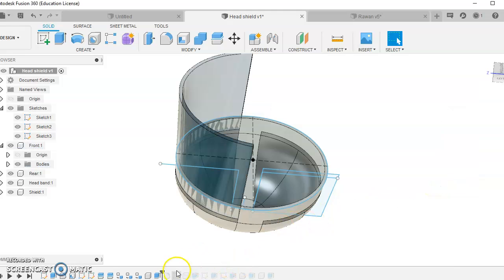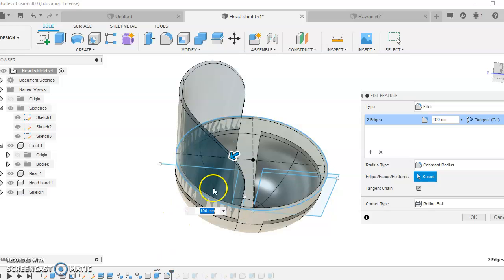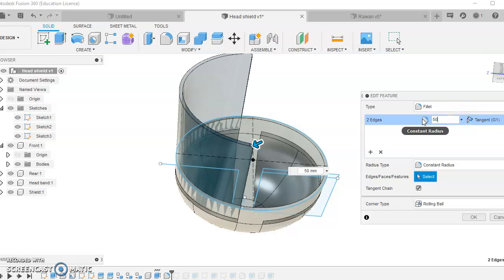You click OK. You then move on to the next bit, radius the edges. And the radius I used, edit feature, I've set those to 100 millimeters. So then you get a nice blend across the side of the face shield. Well, that's up to you. And I'll try 50. You can see what 50 looks like.